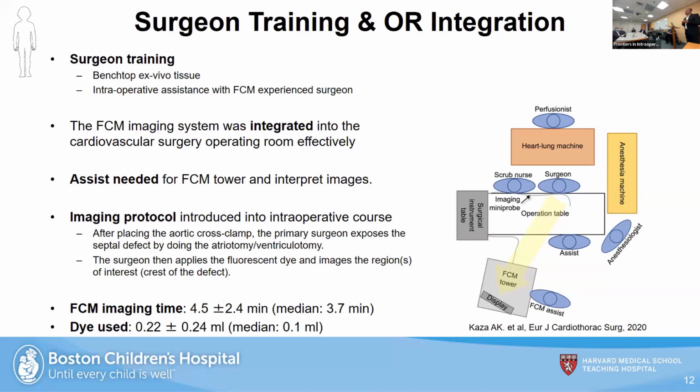Initially, the idea was for the surgeon himself to use the probe for imaging, looking at the image and diagnosing whether they're imaging the conduction, the non-conduction, or the working myocardium. But we found it's much easier if there is an assistant who can help manage the FCM tower while communicating and interpreting the images for him or her.